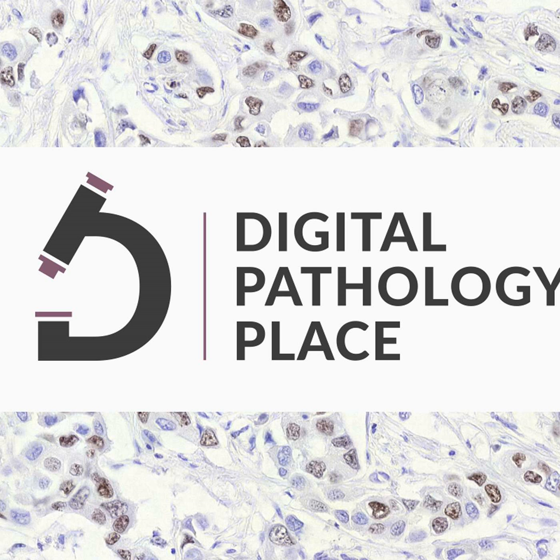What about the workflow and the integration of the scanner with other systems in the lab? How do you evaluate that? How do you approach that? So that's another good question. So we have the scanners, we have NDP serve, which is a server, and then most people have LIS. These units are used mostly in the research realm. So some people have LIS, some people don't.